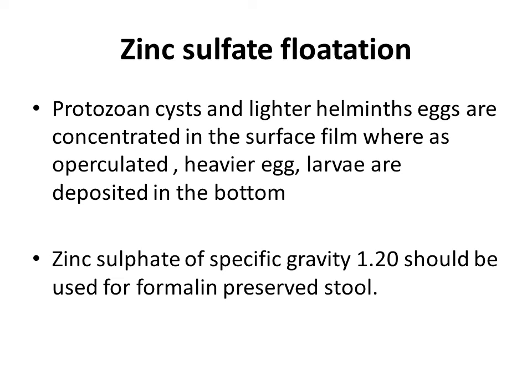Zinc sulfate flotation. Here we can detect protozoan cysts and light helminth eggs. Helminths means nematode, trematode and cestode eggs, which are concentrated here. Normally flotation means we are collecting the parasitic stages from the top of the solution.